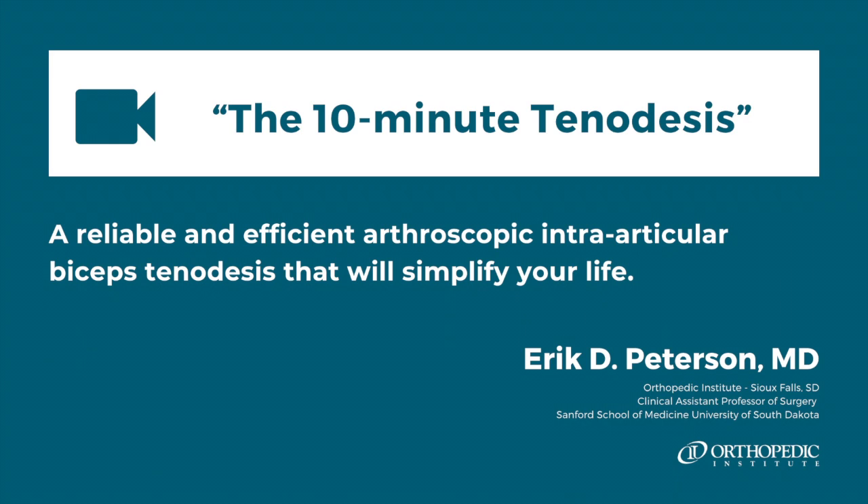This is Eric Peterson from the Orthopedic Institute in Sioux Falls, South Dakota. This video demonstrates my technique for arthroscopic biceps tenodesis.